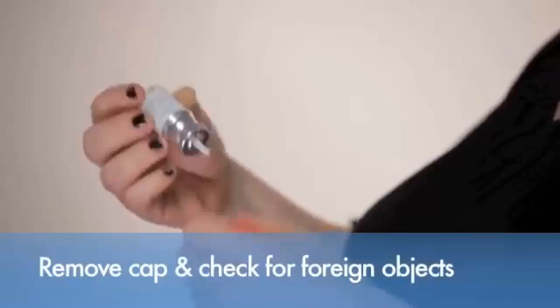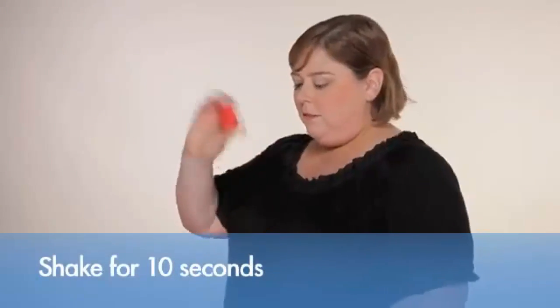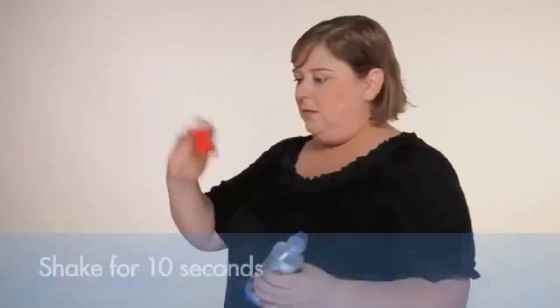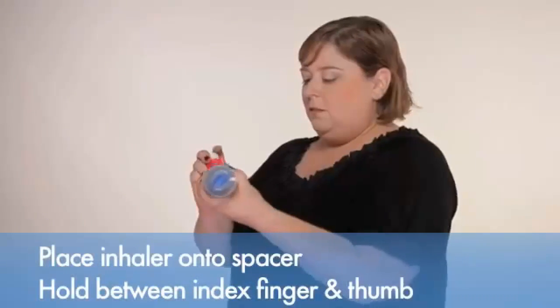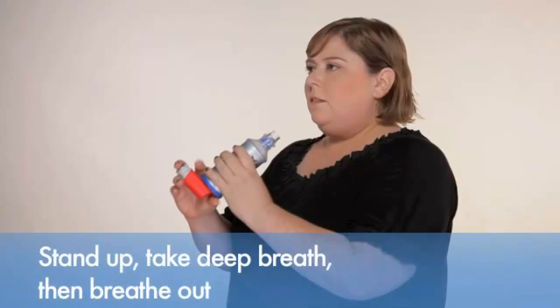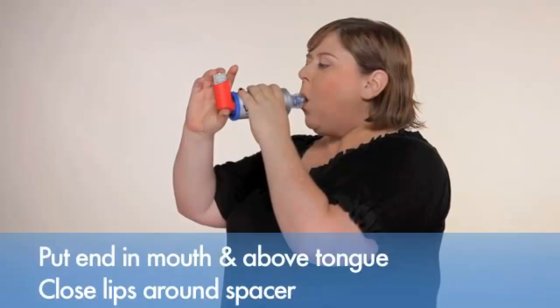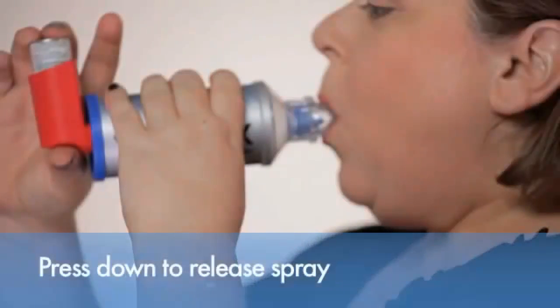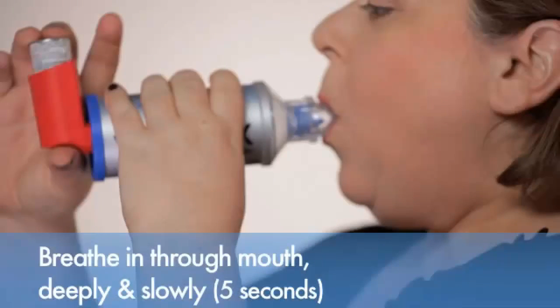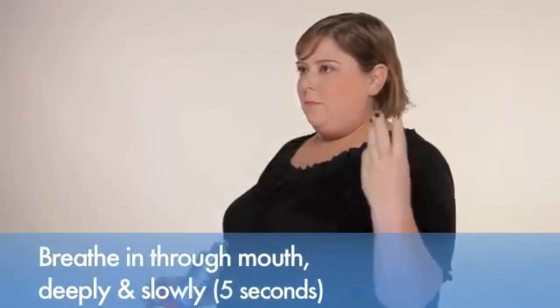Make sure the inhaler and spacer are free of foreign objects. Shake the inhaler for ten seconds to mix the medicine and remove the cap from the mouthpiece. Place the inhaler mouthpiece onto the end of the spacer. Hold the inhaler between your index finger and thumb. Stand up and take a deep breath in, then breathe out as much as you can. Put the end of the spacer into your mouth between your teeth and above your tongue. Close your lips around the spacer. Press down on the inhaler to release the spray and begin to breathe in through your mouth.